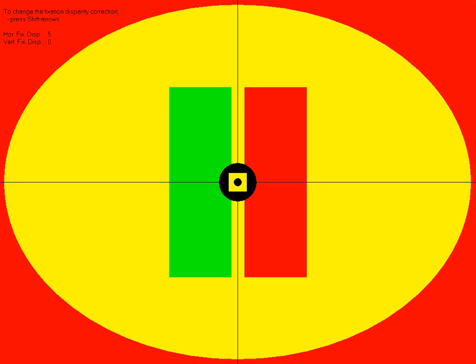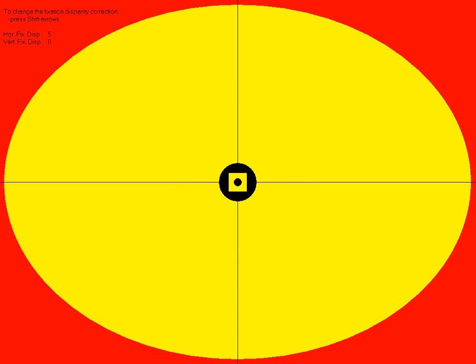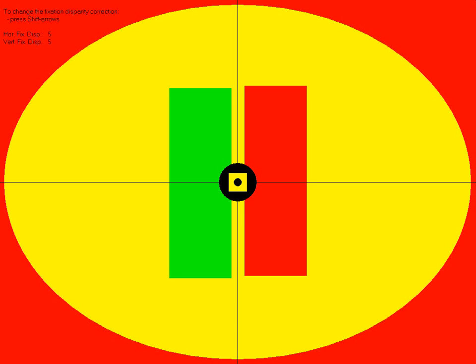If a fixation disparity causes the two rectangles to be misaligned, you can use the Shift plus arrow keys to align them. A whole series of these first choice direct comparison tests will determine the amount of aniseikonia as well as the measurement consistency. Let's skip the rest of this test and look at a previous result.